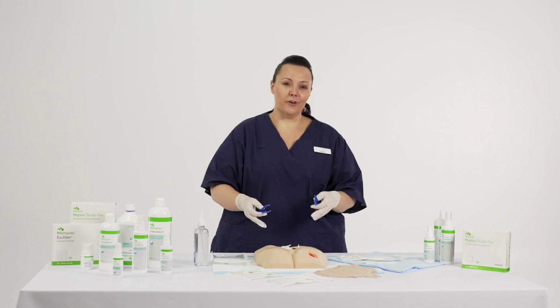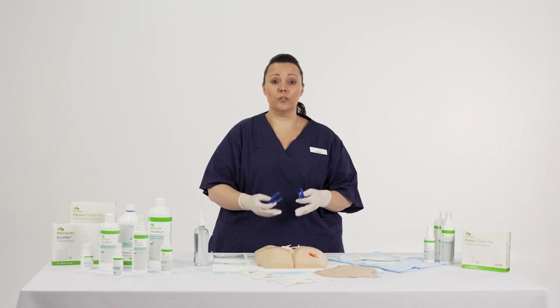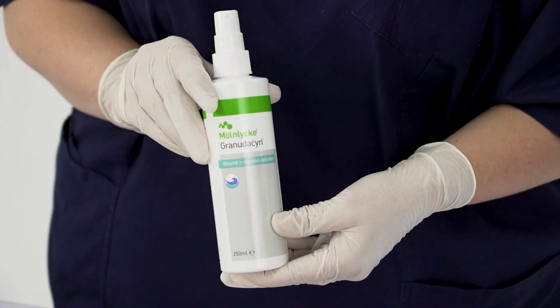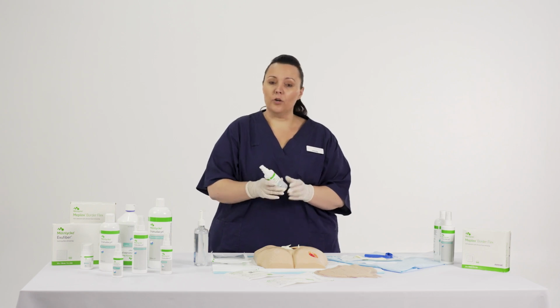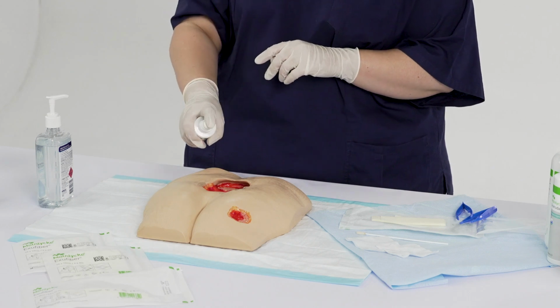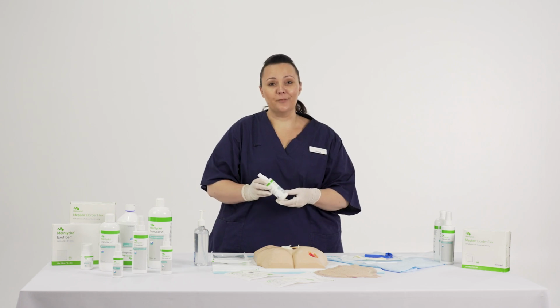If you have a necrotic area that is soft and boggy and you believe by good hydration you could lift that area, you could consider other products such as a wound gel. In this case, Granudacyn wound gel may be an option for you. It is easy to apply and all you need to do is spray the area. Once applied, it does form a gel.